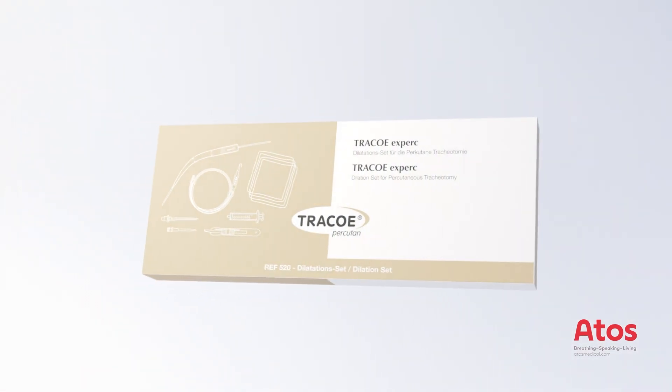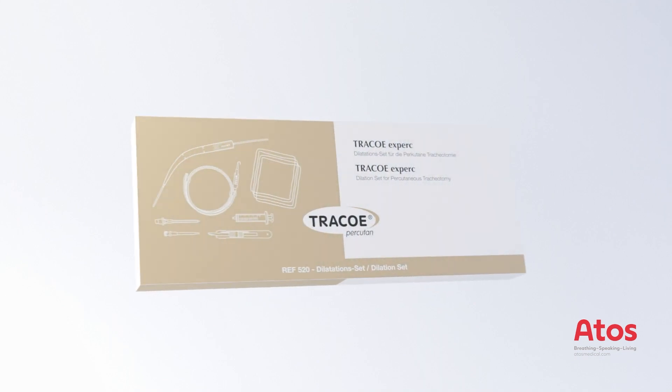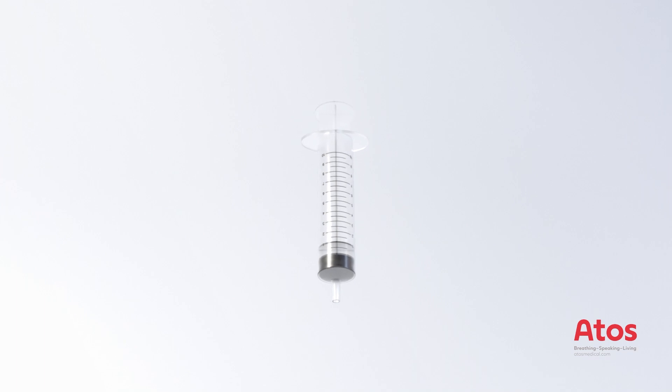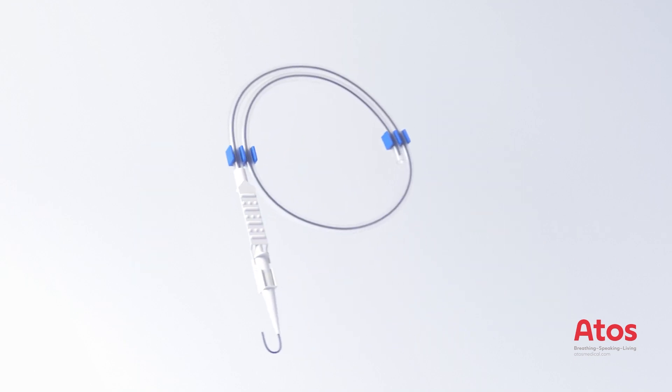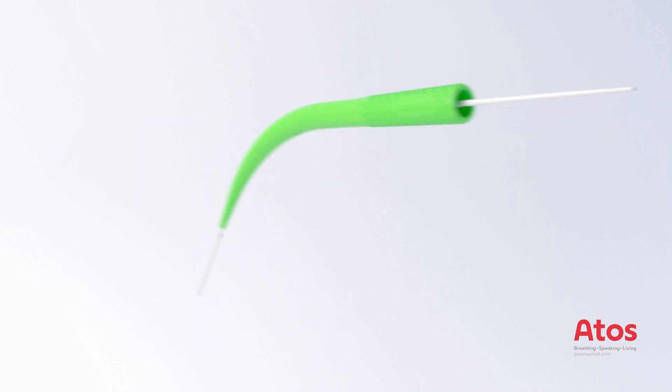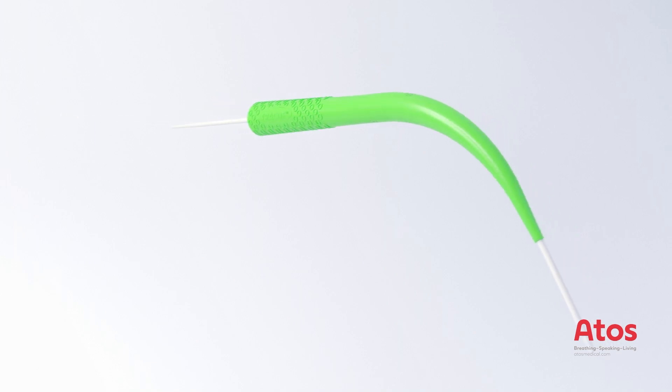Percutaneous dilation tracheostomy has become established as a standard technique in intensive care practice. The Ciaglia technique is widely used. The TRACOE experc dilation set includes compresses, a syringe, a puncture needle with Teflon catheter, a safety scalpel, the blue pre-dilator, a kink-resistant guide wire made of nitinol according to the Seldinger technique, and the green experc dilator with hydrophilic coating and guiding catheter with safety stop.